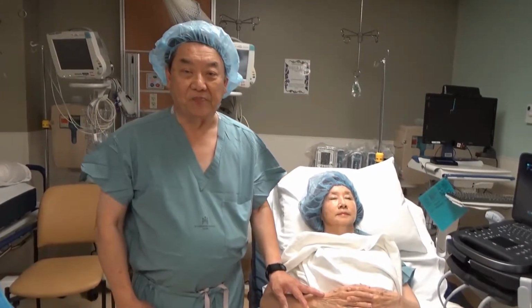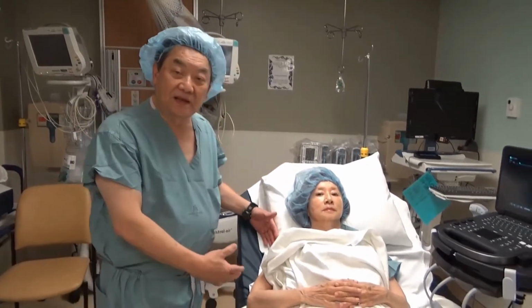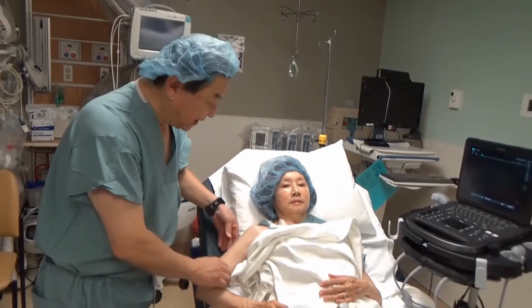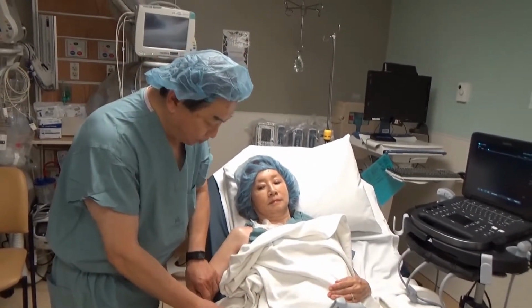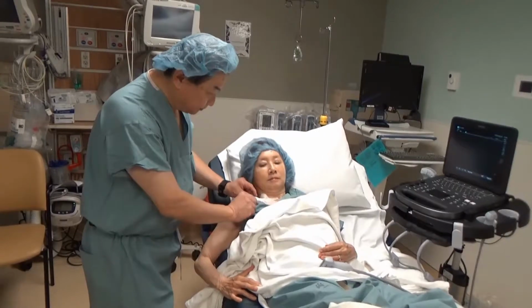Now, the first thing I'd like to do is show you how we position our patient. So I have Linda in the semi-reclined position, and I have her coming off to the edge a little bit. And then notice how the arm is slightly put along toward the rail.